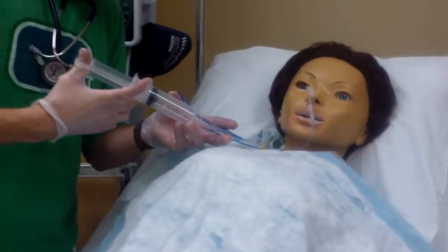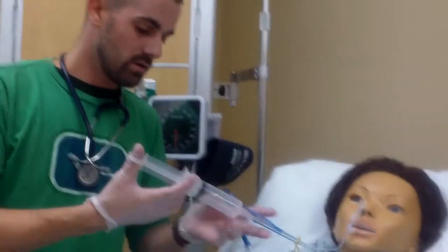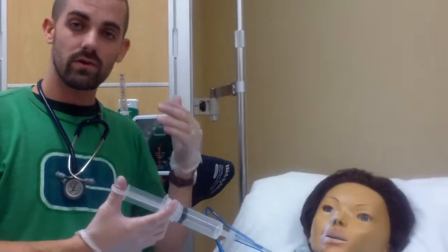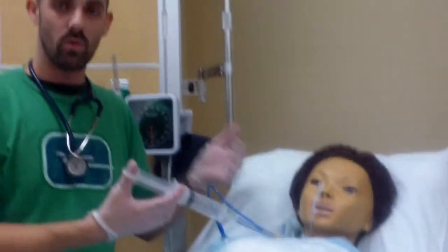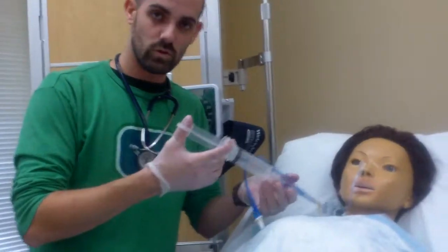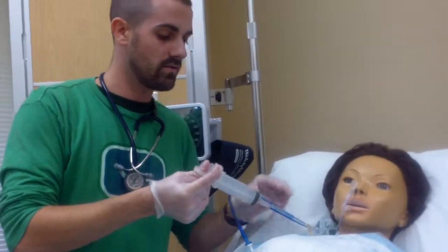60 ml syringe, and I'll say it comes up to 40. So there's only 40 milliliters of residual. Therefore, according to facility policy, if this is going to go back in the NG tube or if I'm just going to dump it, we'll say this facility's policy says to put it back. That's fine.